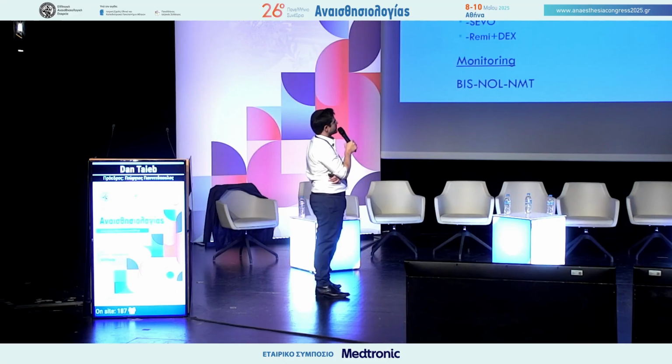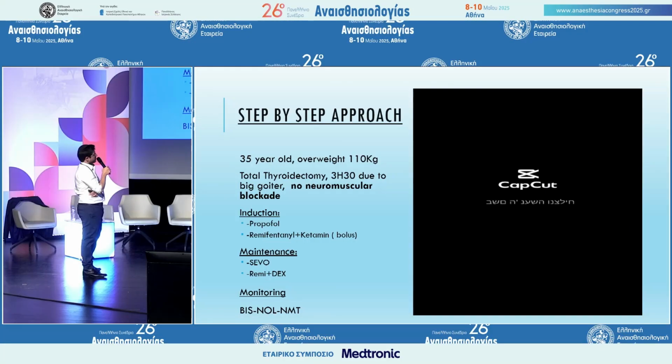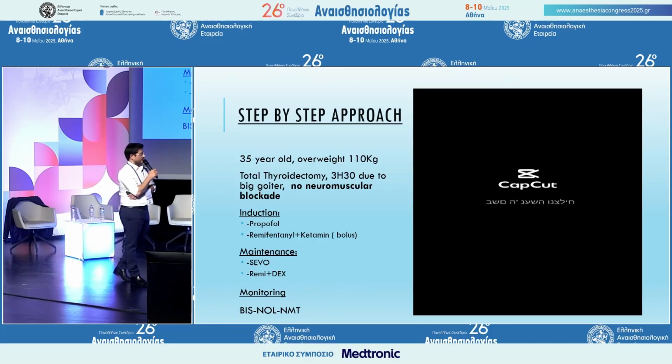This is a screen after surgery. Blood pressure completely stable all over surgery. And this is the way you're using NOL monitoring in everyday practice, in order to remain on the right level of our drugs.